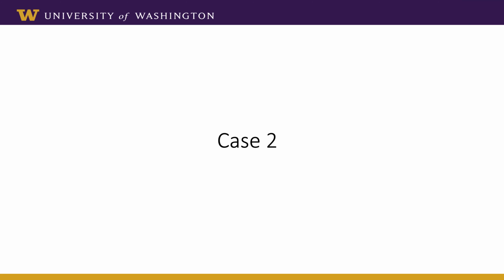I can't remember in this guy if he'd had a line and a hematoma or something already, but sometimes if there are other issues, I'm less married to it, just because the radial complications, when we do have them, are such a mess too. But I think you're right. A lot of it comes down to case planning.